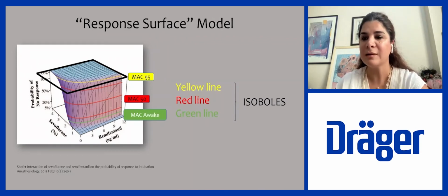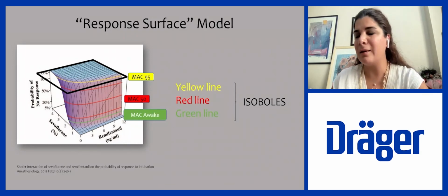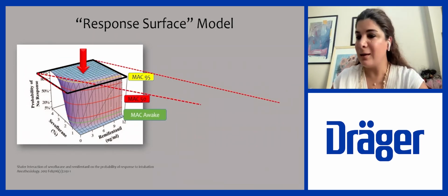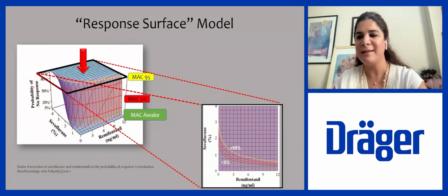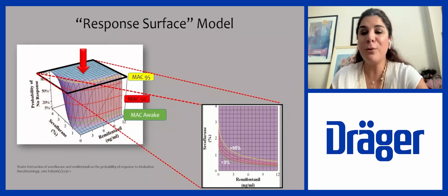As a commercial product, SmartPilotView incorporated these synergistic interactions into its operating principles. The main mechanism is that isobol lines in a two-dimensional diagram represent areas of probability of how the patient will react to a defined pain stimulus, indicating the level of anesthesia. The best part is that it visualizes the 3D graphic of this complex pharmacodynamic interaction as a 2D graphic form from a bird's eye top view, similar to navigation maps.